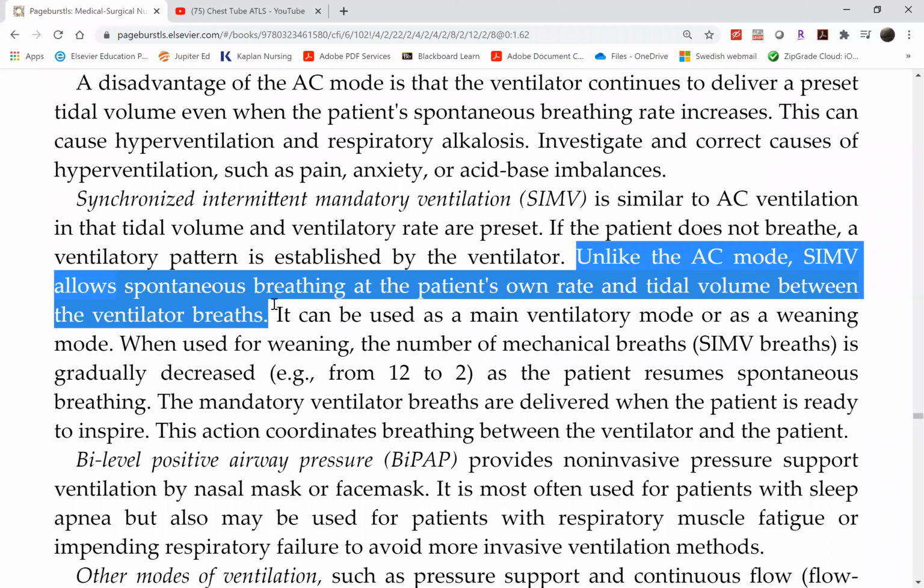Just because you set a tidal volume on the ventilator doesn't mean the patient will get that preset tidal volume. The lung can only get so much, so it will either trigger the high pressure alarm or low pressure alarm, whichever the case is. But the vent does allow some difference. Let's say the usual tidal volume is around 400. The patient may get around 350 or 380, but that's not a significant difference, so that won't trigger any alarm from the vent.